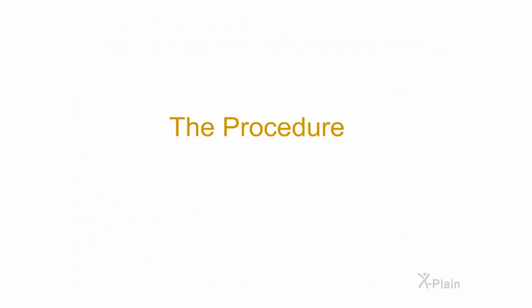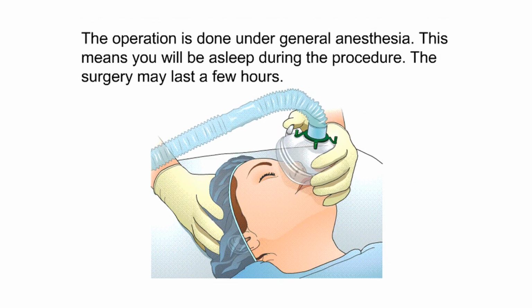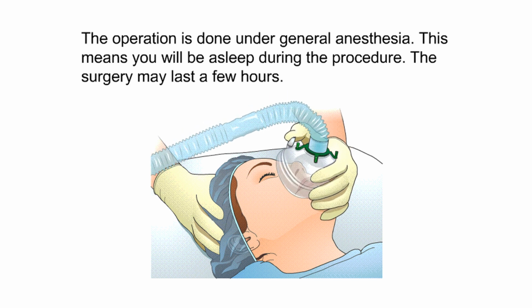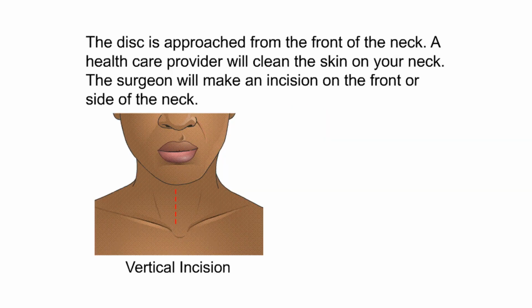The procedure. The operation is done under general anesthesia. This means you will be asleep during the procedure. The surgery may last a few hours. The disc is approached from the front of the neck.